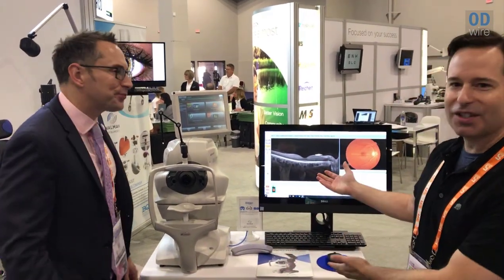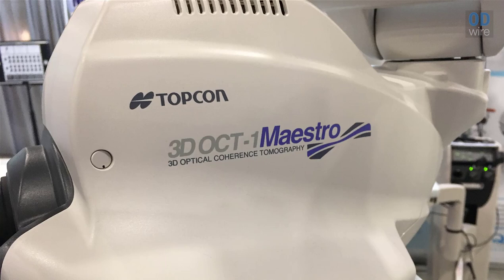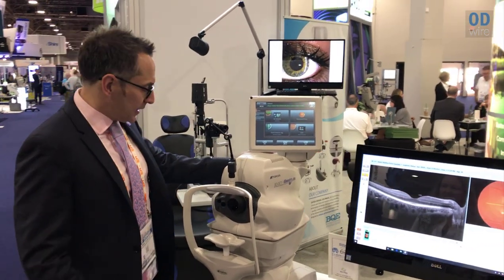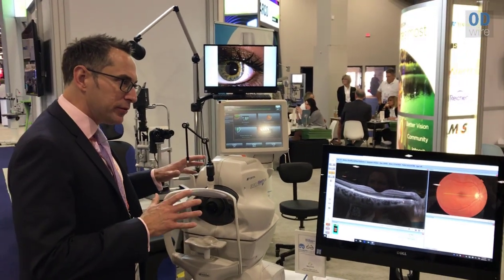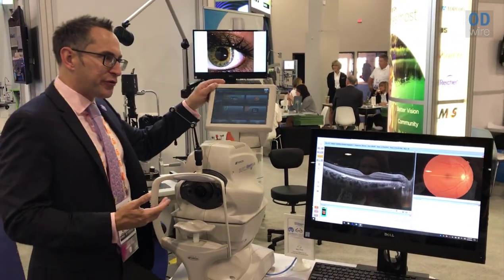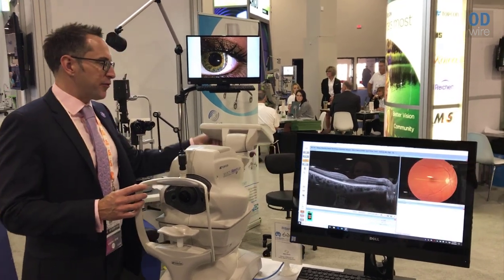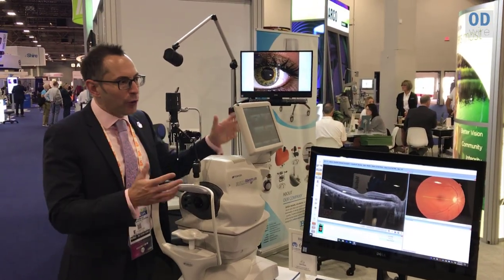So why don't you step us through the Maestro? The Maestro is a fully automated OCT and fundus camera combined. It's capable of taking both eyes in less than 60 seconds. It's an extremely flexible instrument — we can drive the instrument from behind, like a standard fundus camera, or we can drive it from the side if you're short on space.